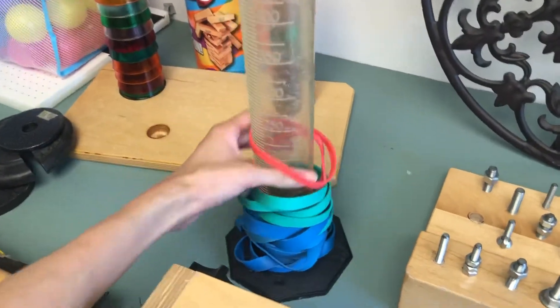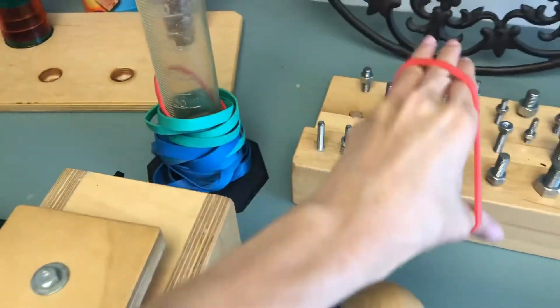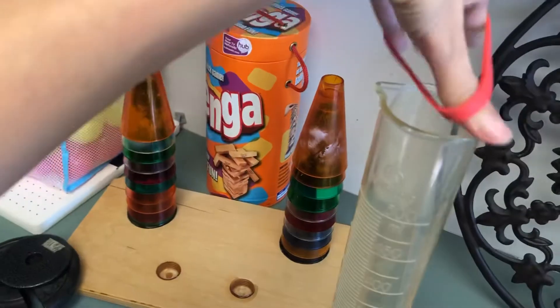This is good for your finger extension, which is bringing the fingers out. And then putting it back on.